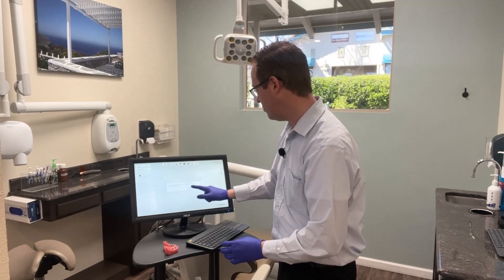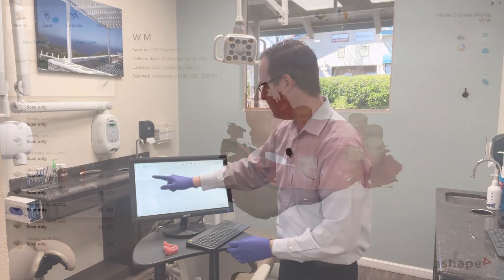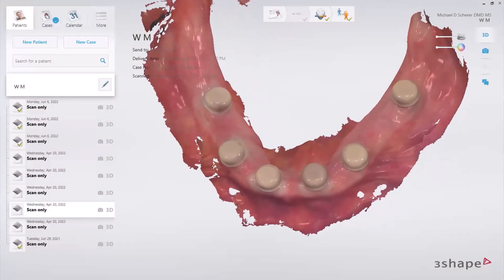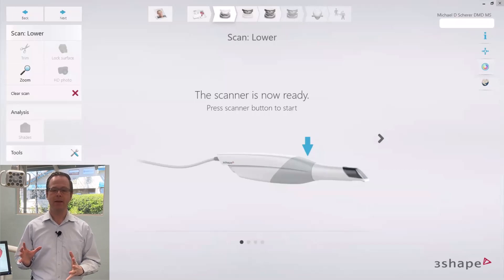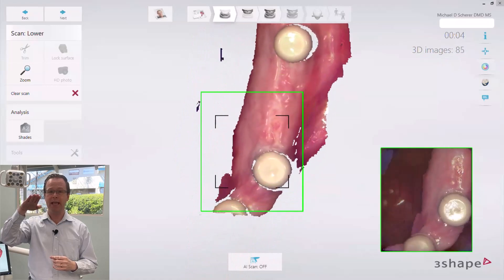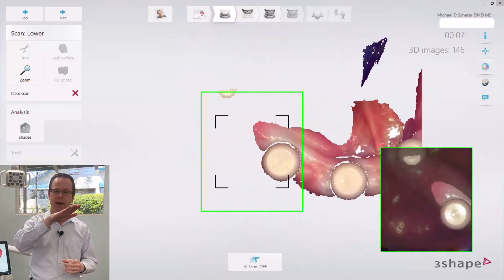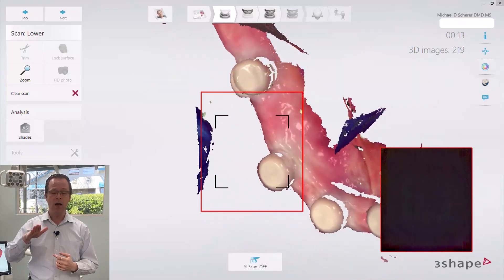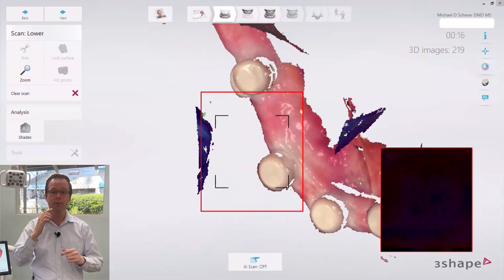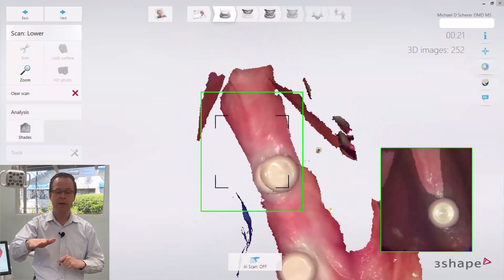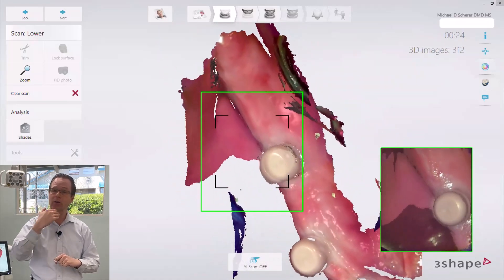Now coming back to that patient I showed you before, let's review the actual scan footage so you can see it up front and close on a real patient. As I open up the scan, I start by scanning from the lower left. Notice I start by holding my scanner away, bouncing out as I slide across the edentulous ridge, crossing the midline going over to the patient's right side. I started to pick up a little bit of double image — abort. I go back to the midline, bounce down to pick up some of the vestibular area, and you can see my assistant's mirror holding the tongue back.